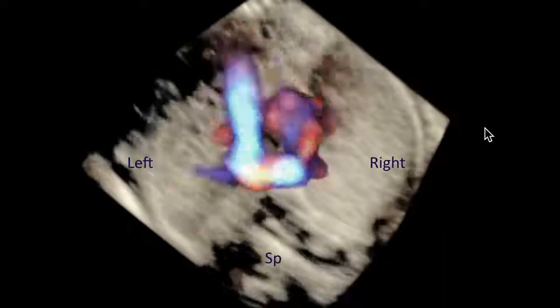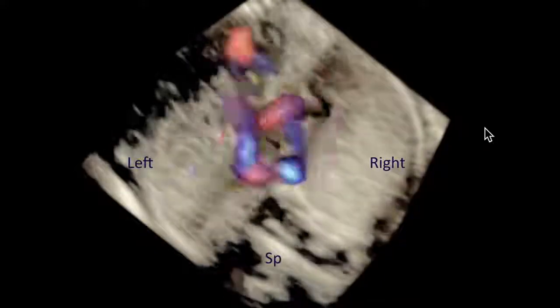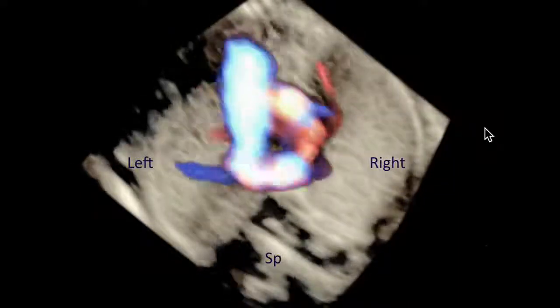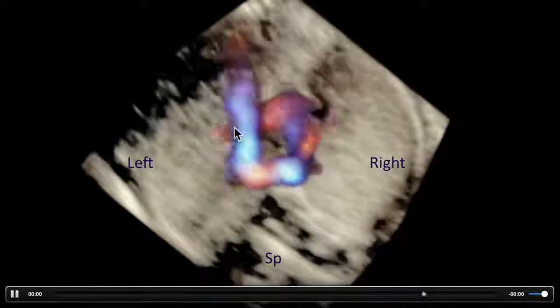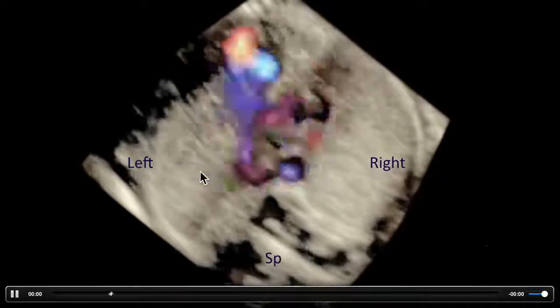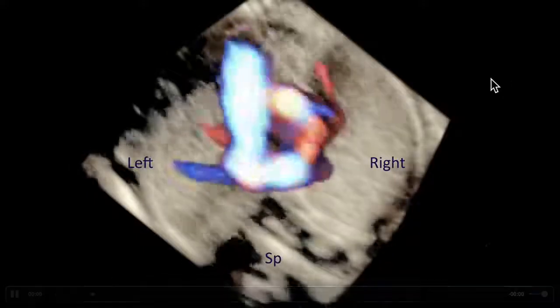Here, this is probably familiar to you just after Alfred's talk, here's an axial chest view of an abnormality of a left ductus arteriosus right arch. So you've got the trachea in the middle and the U-shaped configuration of the PA left ductus right aortic arch. So if you're astute, you'll see that there's another vessel we have here shooting off towards the left side of the chest.